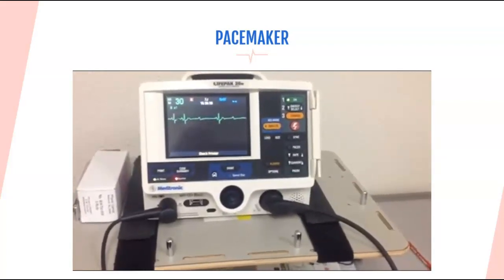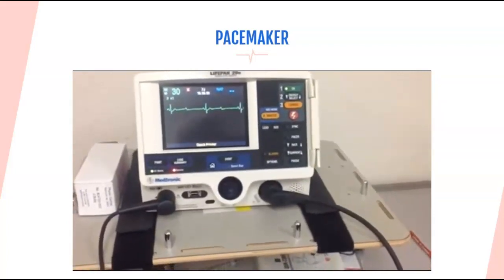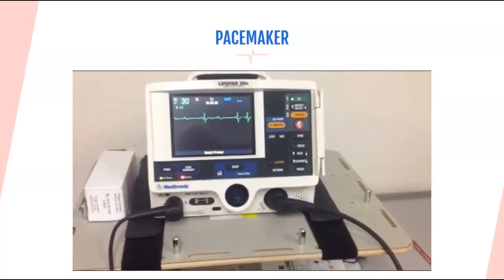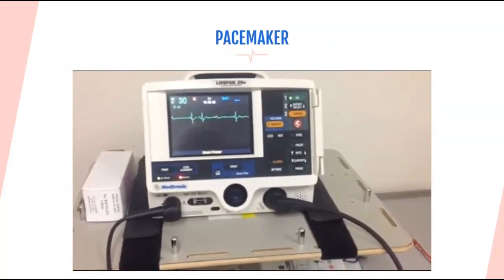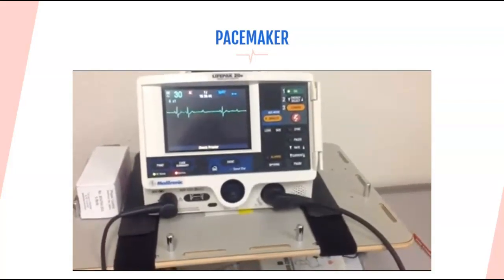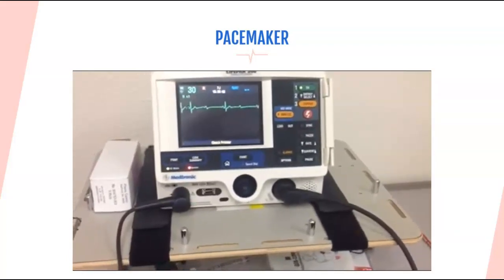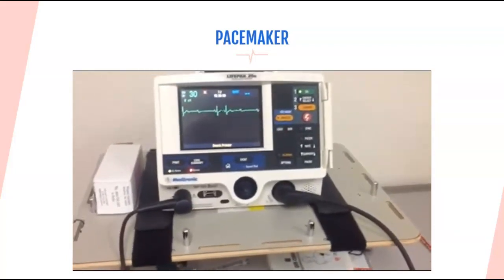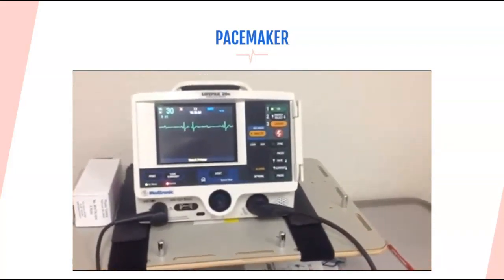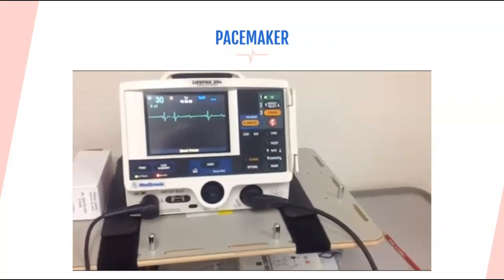And always with pacing, you always want to remember it's a very painful process for your patient. So if you have time to get an IV inserted, and give them some medication like some Versed or Valium, something like that, to kind of sedate them, that's a really great idea. Okay, so here again, we have placed the pads on our patient so that we can pace, and you also will need your ECG leads on the chest as well.